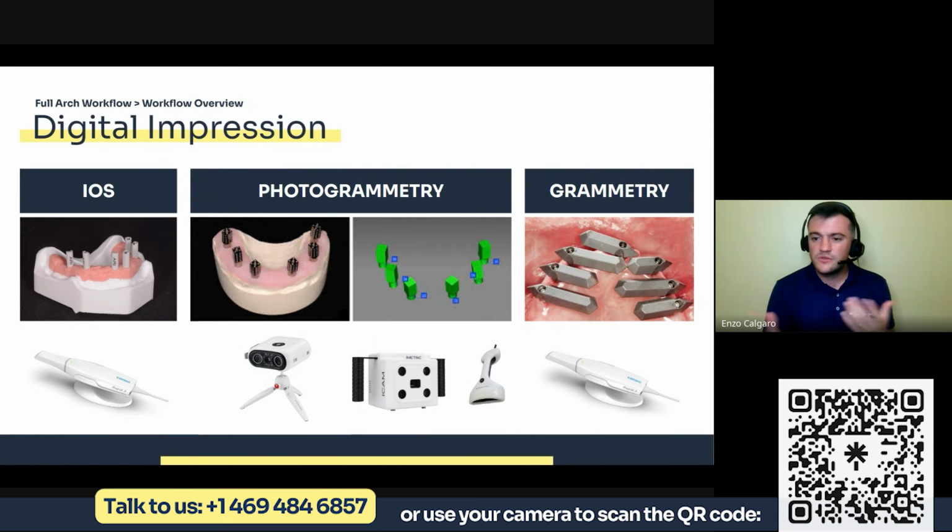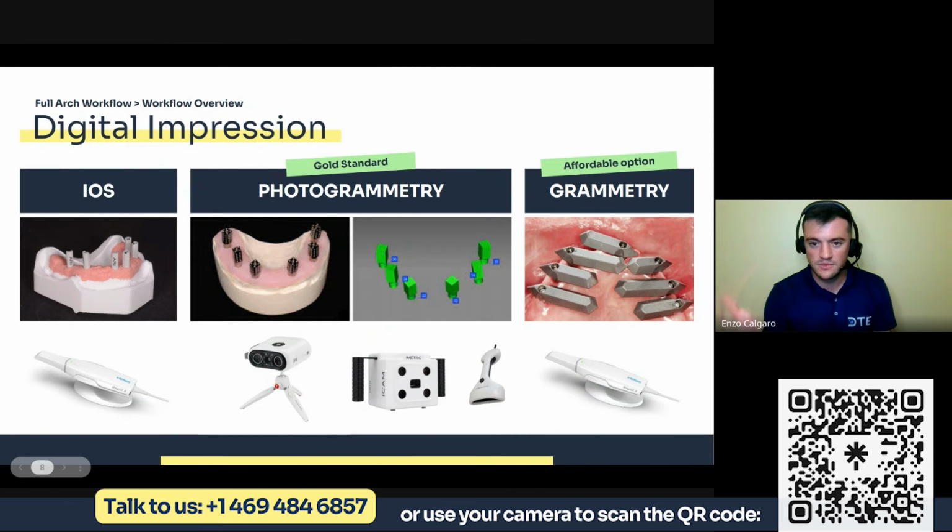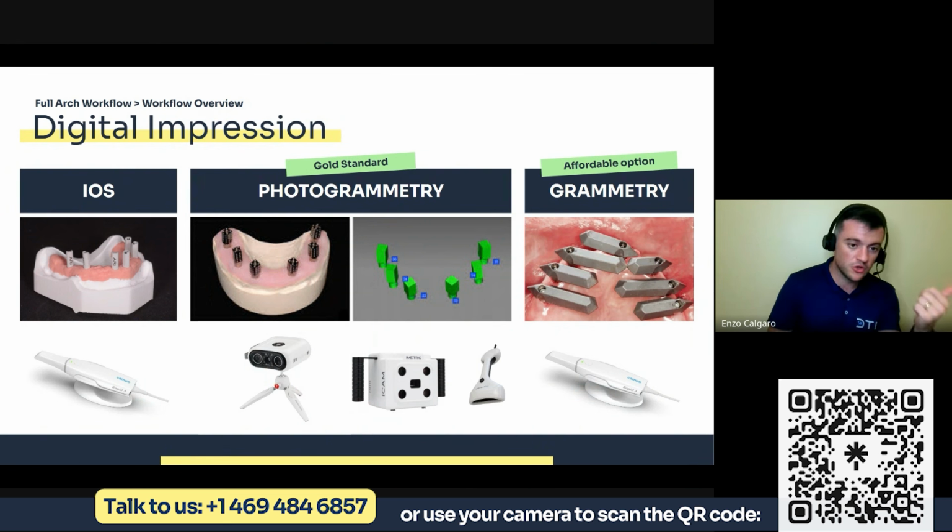But how to choose, which one is better, which one is best, what kind of solution should you look for in your clinic, for your lab? There is no doubt that the gold standard in terms of accuracy and precision for full arches is photogrammetry. The problem is it might not be affordable for everyone. That's where grammetry comes into play. Because remember, with grammetry, you use exactly the same equipment you were using with an intraoral scanner. The only thing you change is the scan body.